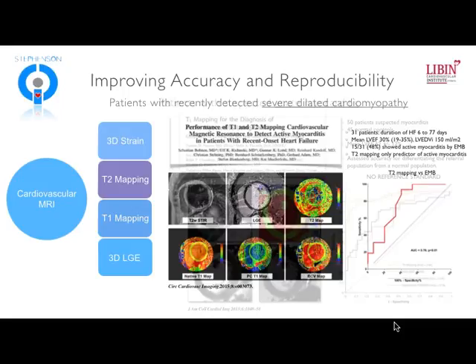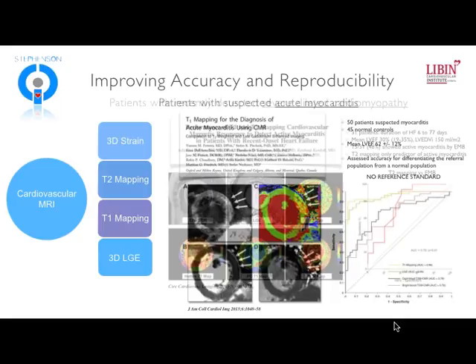But what they tested was the hypothesis that either T1 or T2 mapping might be able to identify those patients with active inflammation. Out of all of the things tested, T2 mapping was the only thing that showed any significant correlation, and a modest one at that. And so whether or not MRI is really a valuable tool for the detection of myocarditis according to their criteria is questionable, but it showed potential signal for T2 mapping in that setting.